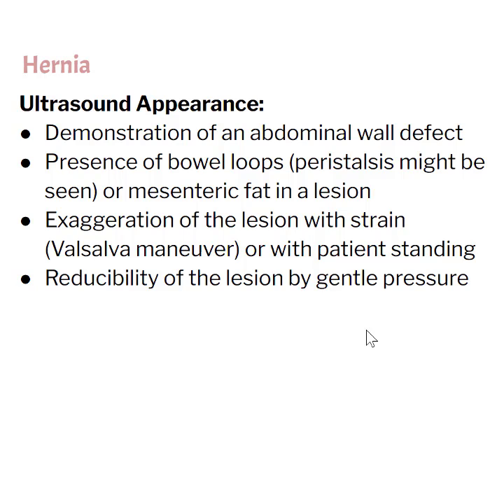One of my favorite ways to get people to do a Valsalva maneuver if they're struggling following those directions is to either describe it as, it's the way you poop, or what I have them do is take their thumb, put it to their lip, and pretend they're blowing up a balloon. That pressure within their thoracic cavity and in their abdominal cavity, as if they were blowing up a balloon, their thumb balloon, actually provides a very nice Valsalva maneuver.